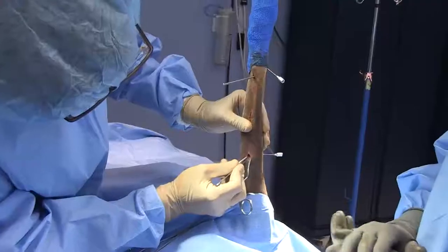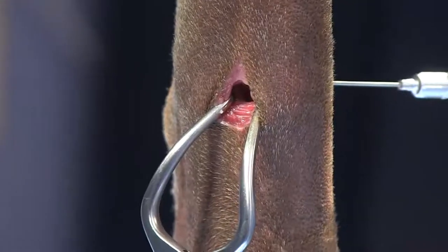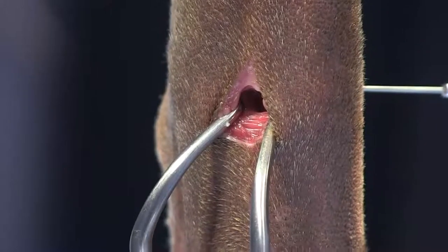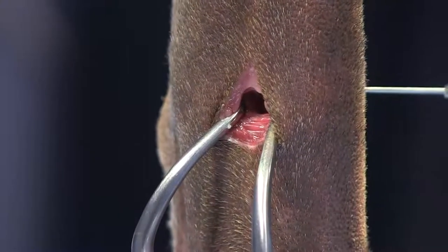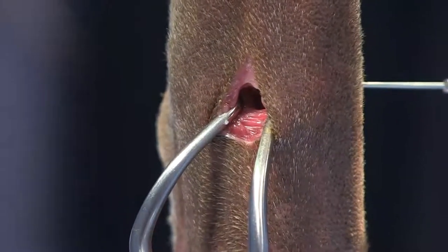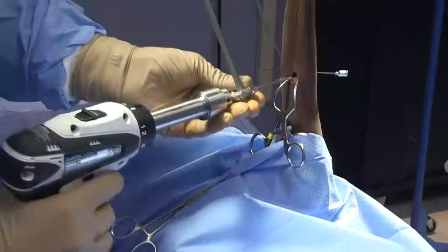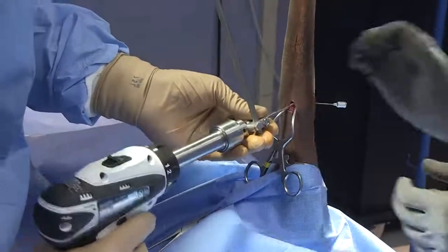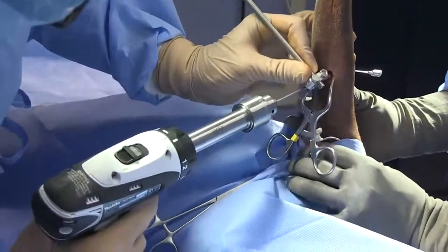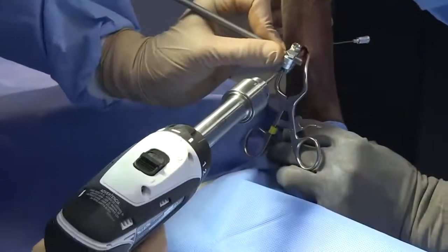We're looking right down on the bone — it's quite important that we're not drilling through any soft tissues. We've got a nice portal with our drill bit right on that bone. This is a very good area to use the drill sleeve, in case you have any soft tissues in your way. What I like to do is get my drill bit in there, bring my drill sleeve down, and make sure my drill bit is actually on the bone. If not, come out and reposition or re-angulate.